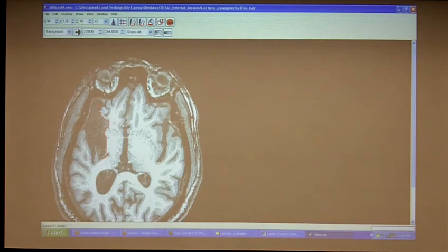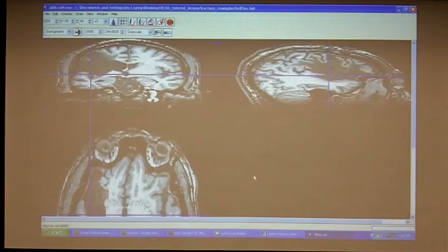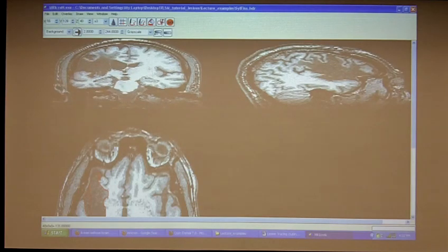So now the question is, does this lesion go all the way out to here, right? Or does it kind of go to here and leave the Sylvian Fissure? One way to tell is to look, when you put your crosshairs here. So this is kind of the area that's in dispute. And then look at it in the other views. And you can see that actually, this is more or less a normal sulcus. Well, normal, it's atrophied, but this isn't. You see this, there's gray matter that sort of loops around here, and you can scroll through a little bit, and you can see that there's this gray matter. It's a big sulcus. It's certainly bigger than you see over here on the other side, but that's just atrophy. So actually, the way we would draw this, well, I'll show you.